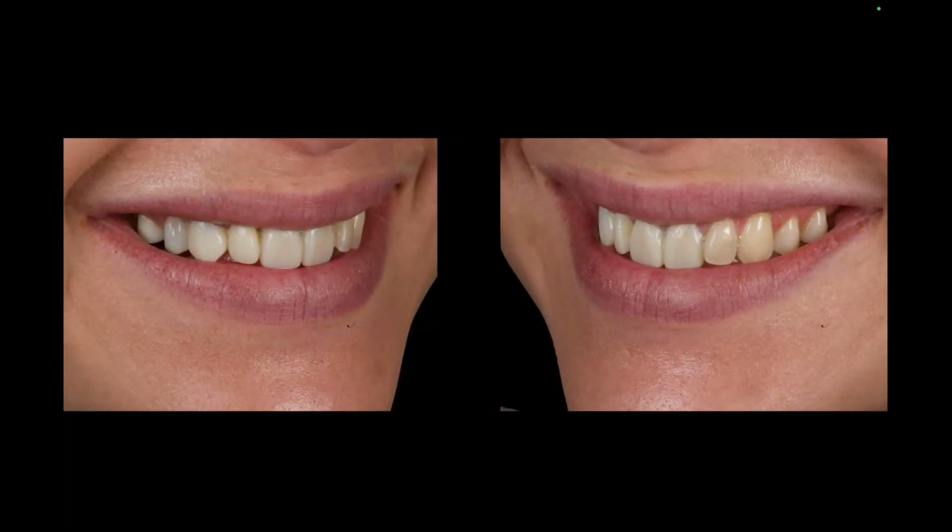So the difference for me, I want the opacious materials more in metal ceramics, lithium disilicates. With zirconias, I want opacious materials, but I have the ability to use more fluorescent materials, similar to metal ceramics. I can just use fluorescent material. So I can swap between the two, between metal ceramics and zirconia, fluorescence or opacity. Lithium disilicate, different challenge, because most of the time you're using lithium disilicate, it's more monolithic.